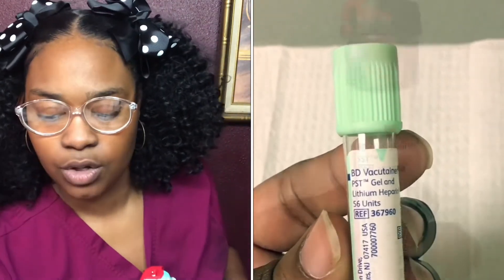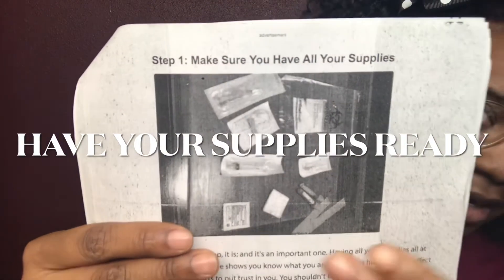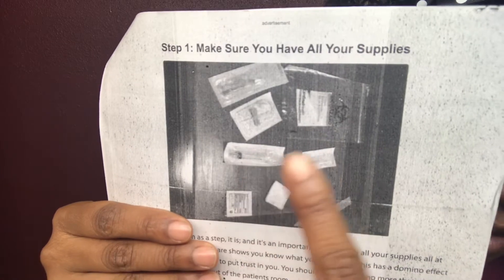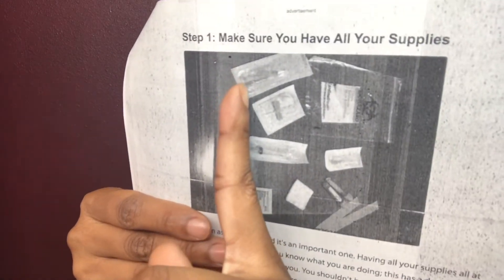Whenever you draw blood you want to try to have all your materials set aside. This flyer I'm going to be looking at has all the materials right here — the tourniquet, your tubes, the needle, your bag for collection, the alcohol wipe, gauze, the butterfly needle, and the evacuated tube. The most important thing first: always make sure you have all your materials set up before you try to draw blood, because you don't want to be running around to go get something.